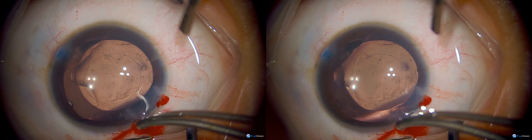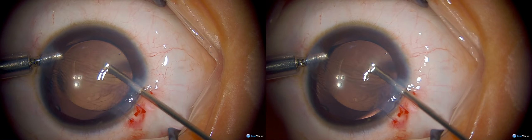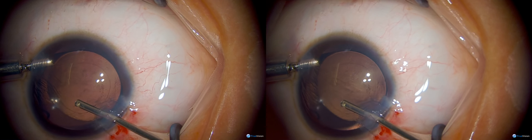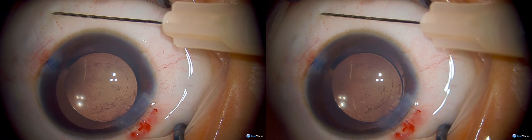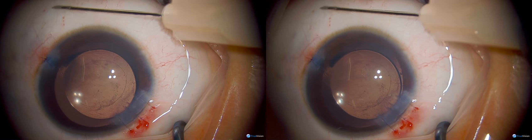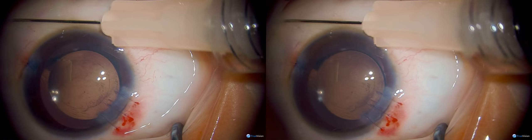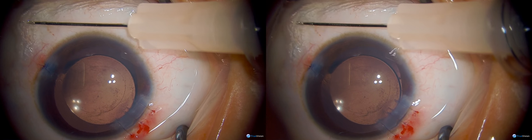Once that's in place, a suture is placed across the corneal incision to tighten it up again. Now using the vitrector to remove the viscoelastic from the anterior chamber, and then placing some subconjunctival antibiotics and steroids. This step is optional but may be preferable if there's any chance that follow-up could be poor with your patient.